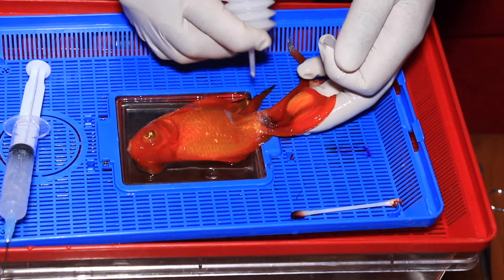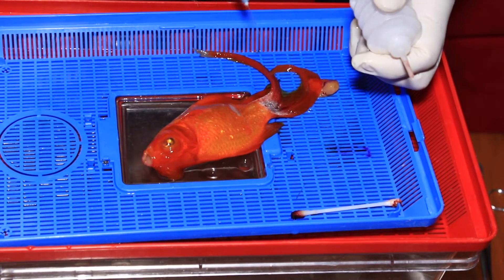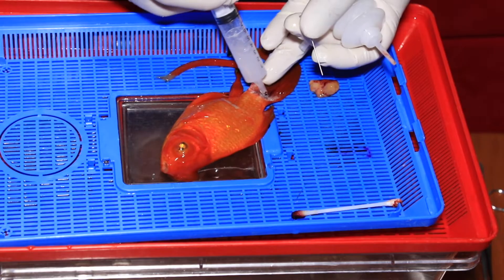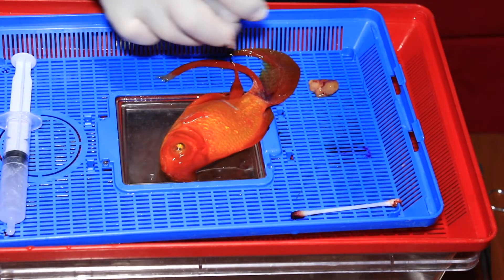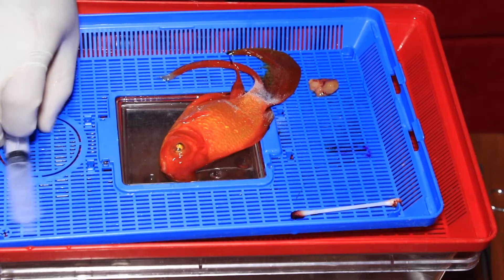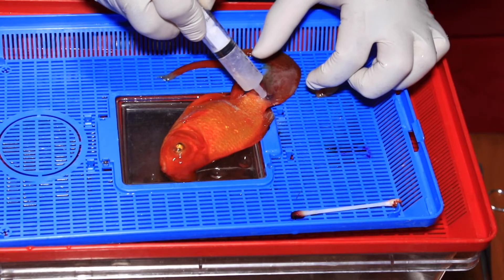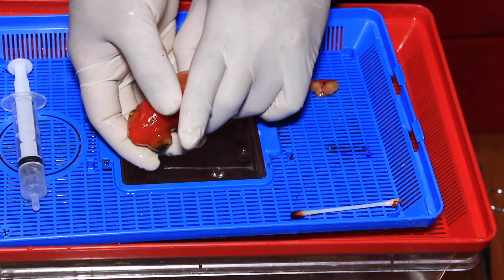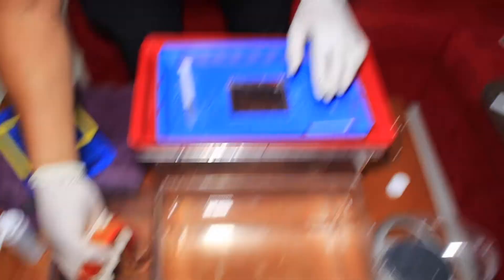She's waking up from the anaesthetic but we've already got the anti-inflammatory on board — she's just flicking her tail wanting to wake up. At this stage we won't give any more anaesthetic because we want her to recover fully and quickly. We're applying the fish bandage now — very light layers of fish bandage plus enrofloxacin diluted with a bit of water, applied topically, allowing the powder to absorb it. Now she's ready to go back into her recovery tank, which is plain water with no anaesthetic. Once she wakes up sufficiently we'll put her back into the main tank.